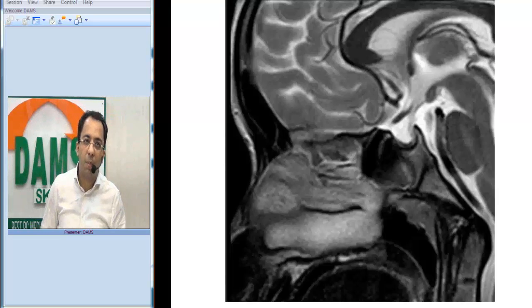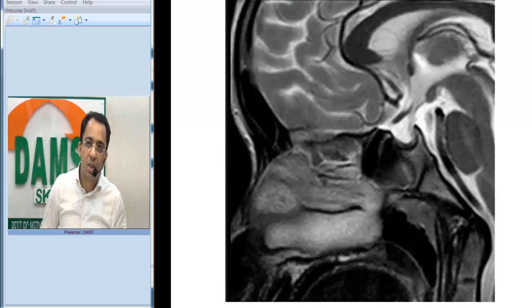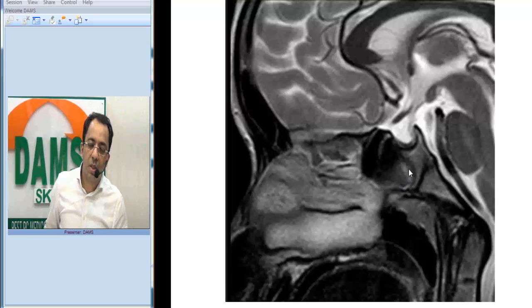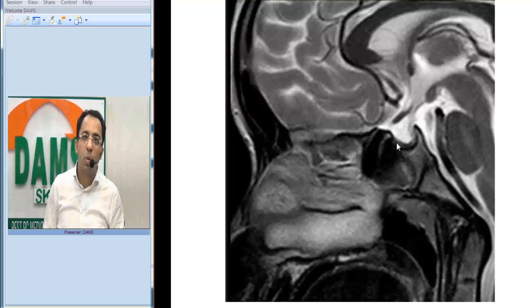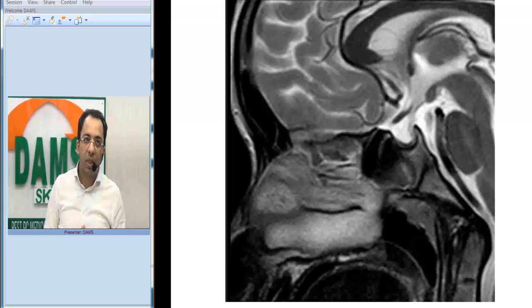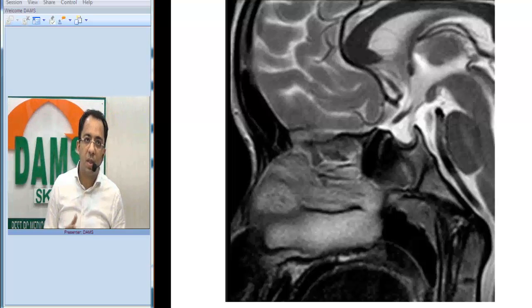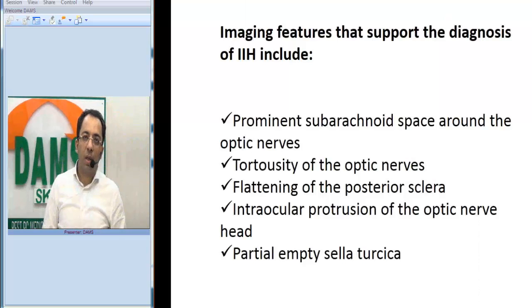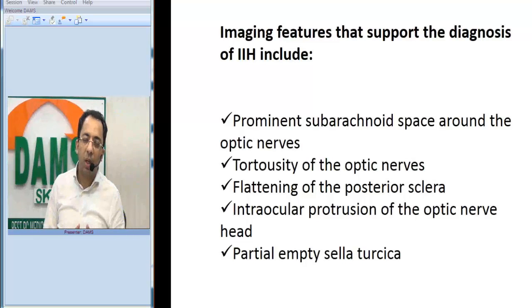When we look at the sagittal T2-weighted image in the same patient, this is the sphenoid sinus, this is the sella turcica, and this is the area of the pituitary. The pituitary gland is flattened. So the findings are: no space-occupying lesion, no other cause of raised ICP, but a flattened pituitary gland, tortuous optic nerves, and prominent fluid in the optic nerve sheath.